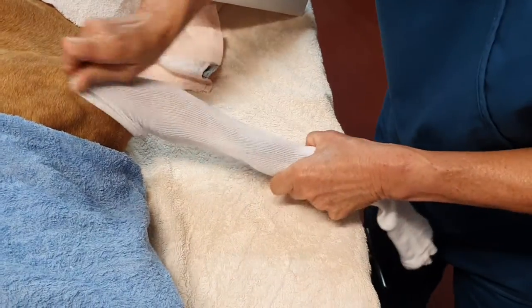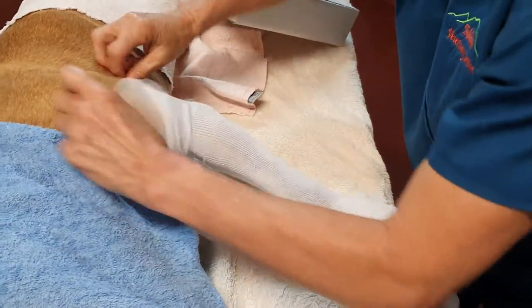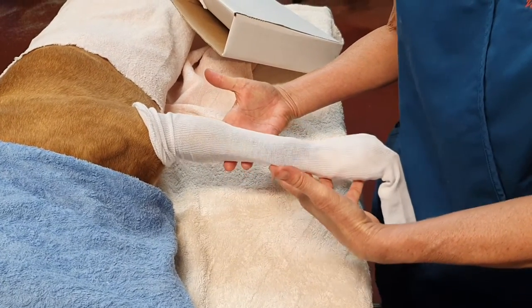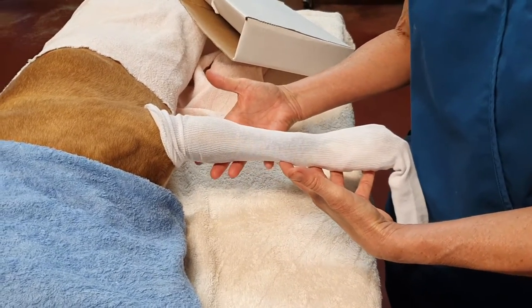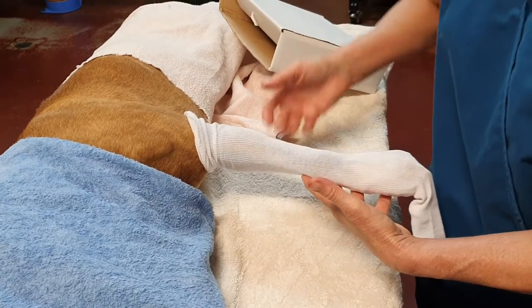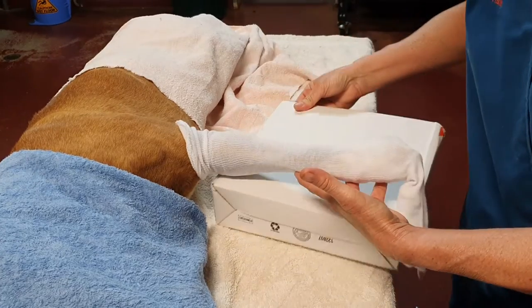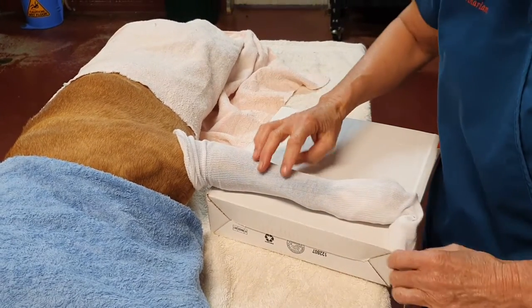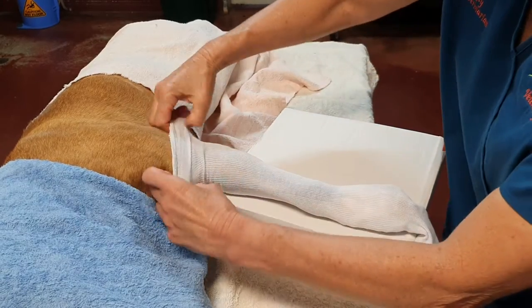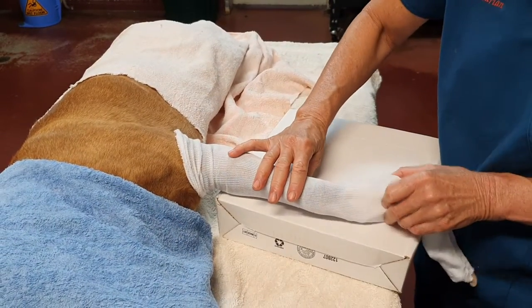And down we come. If this was fractured, I'd have an assistant holding the leg just to keep it in alignment. If I'm working on my own and it's a leg that's not broken, you can rest it on something like so — which we might just do for this demonstration. Just want to be careful that we have a well aligned leg after the splint's applied.